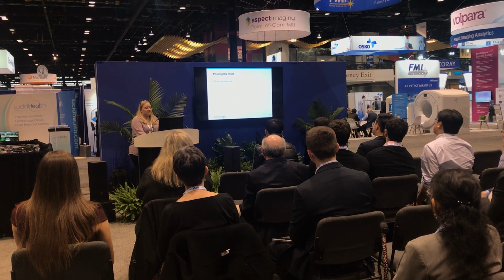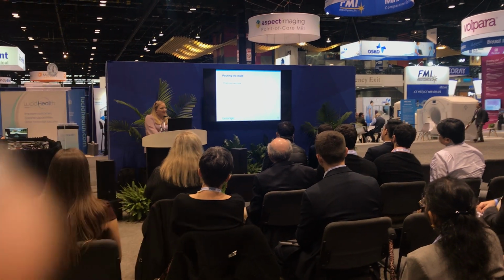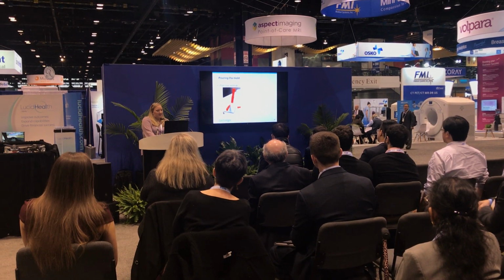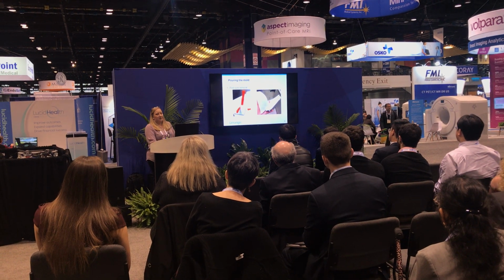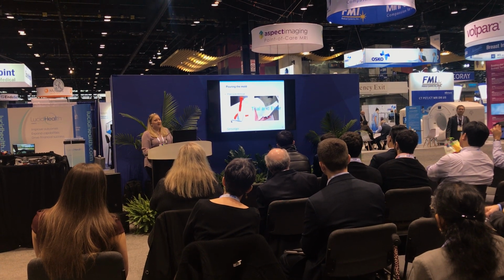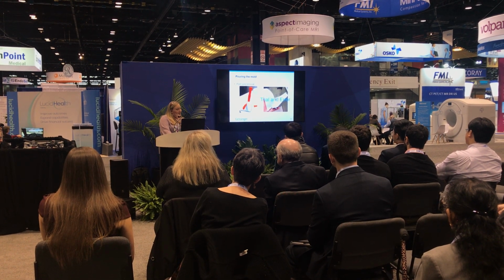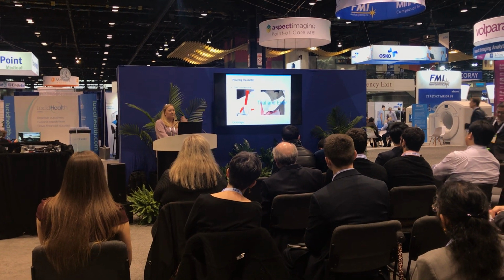Once your model is cured, you can remove it. Sometimes that's a lot harder than you think it's going to be. So we really like using wedges. Just be careful though, because there's going to be times where you're pulling a little bit too much and, like I said, honestly, it's trial and error. You'll feel when it starts to give, you'll feel when it's not, and you're going to break your mold a little bit. This is how Geisinger has been doing it. Just mess around and see what works for you.